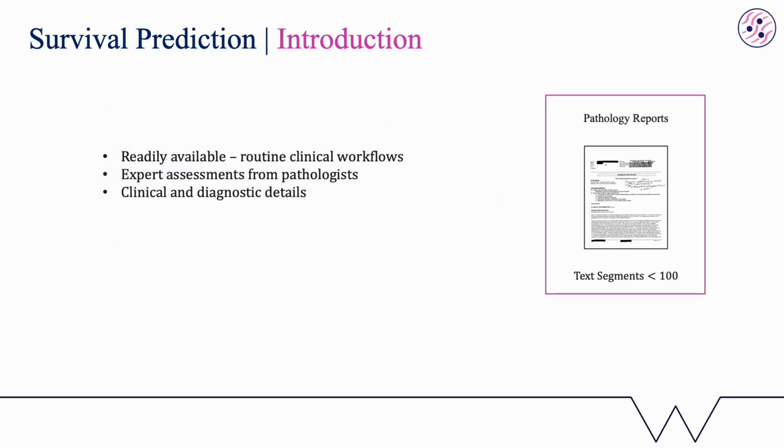This is in spite of the fact that pathology reports represent a readily available source of medical knowledge and are routinely prepared as part of standard clinical and diagnostic workflows. Moreover, they contain expert-derived diagnostic insights and can complement histology and genomic data.